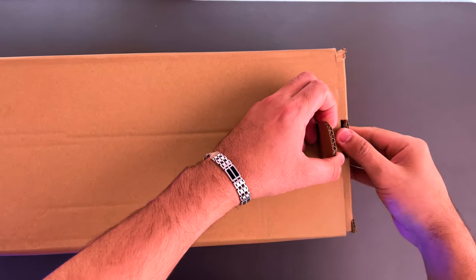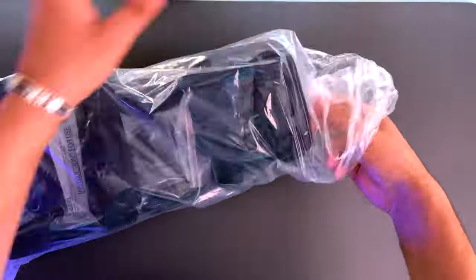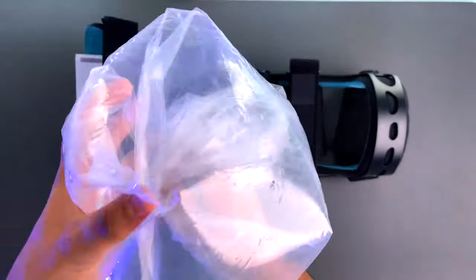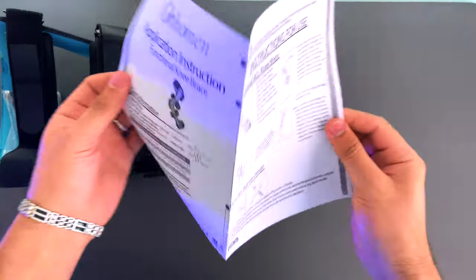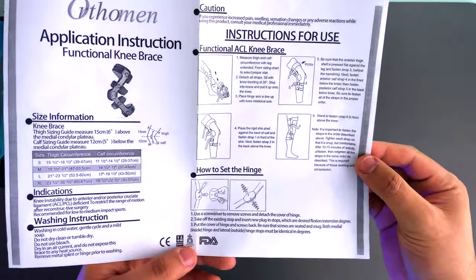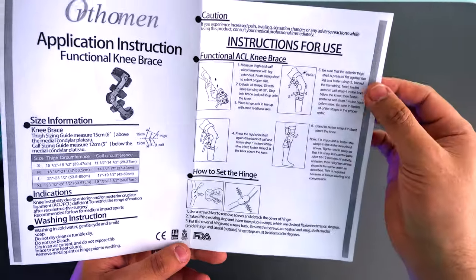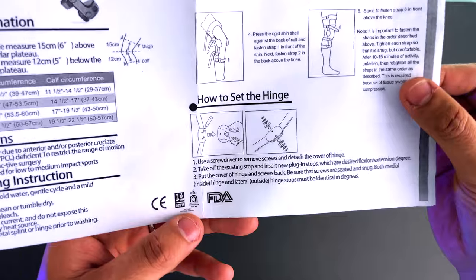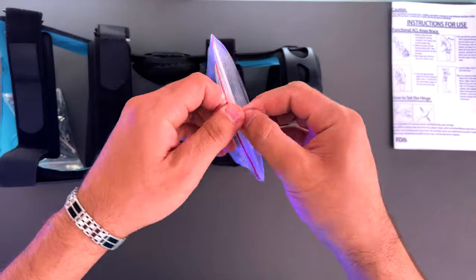Inside the box, the first thing we see is the functional knee brace for ACL, MCL, PCL, and sport injuries. I got the left. The first thing we also have here is the manual, which has all the information on how to install it, what comes in the box, how to use it, and all that — keep it handy because you're going to need it.